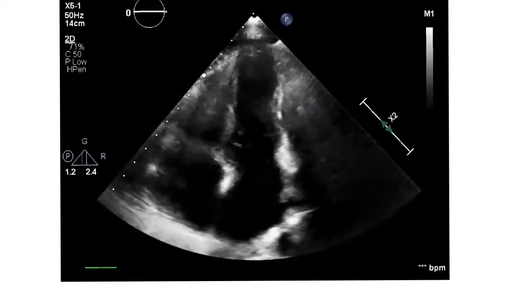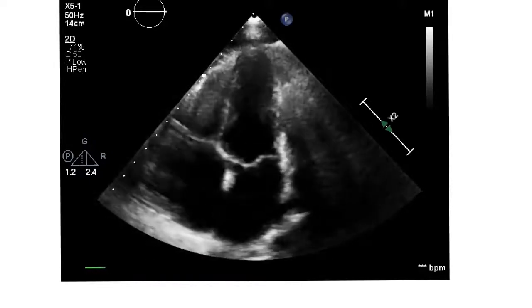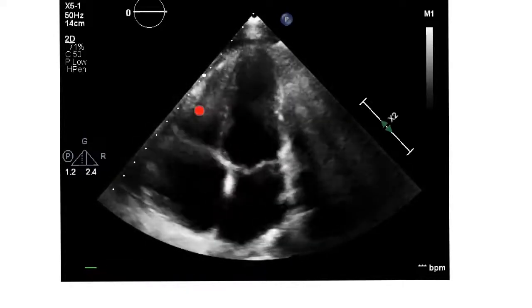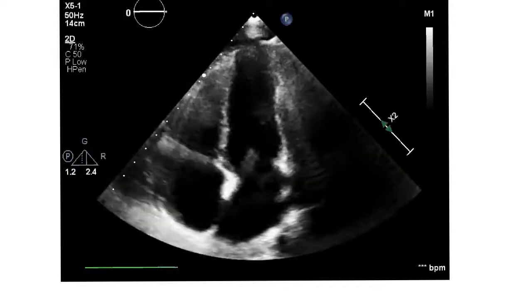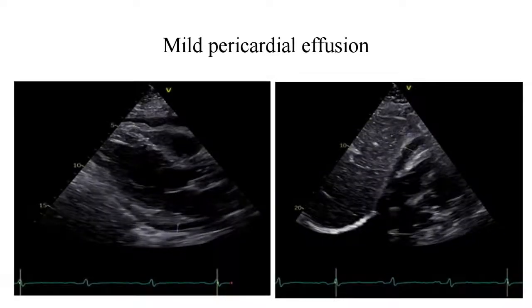In the apical four-chamber view, all four chambers are seen — left atrium, left ventricle, right atrium, and right ventricle. The septum demonstrates evidence of both septal shift as well as the shuddering movement. In addition, this patient had some mild amount of pericardial effusion, which can be present in 10 to 15 percent of patients presenting with constrictive pericarditis.